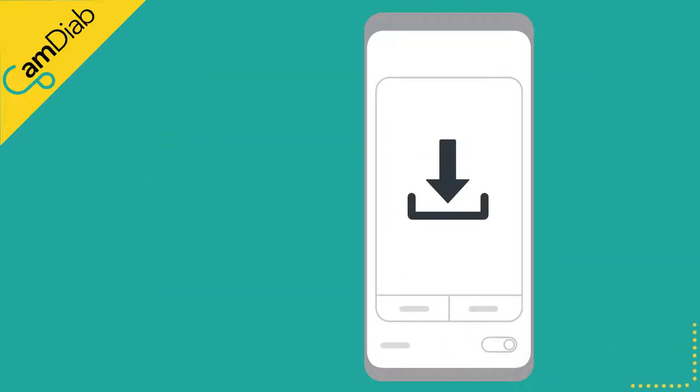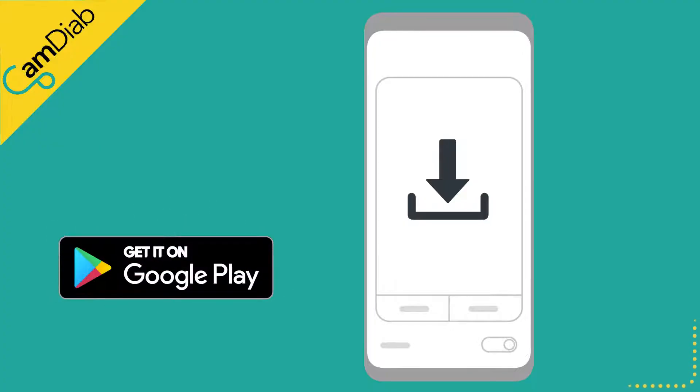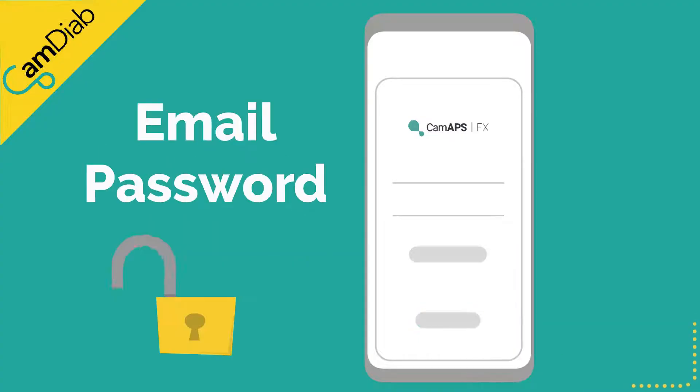Please download the MyLifeCam APS-FX app from the Google Play Store onto your compatible Android smartphone. Create an account using your email address and choose a secure password.